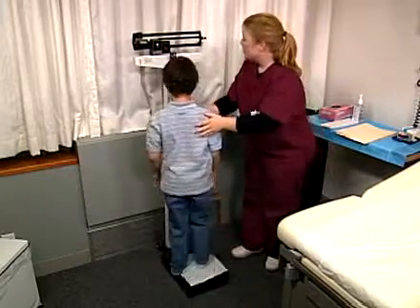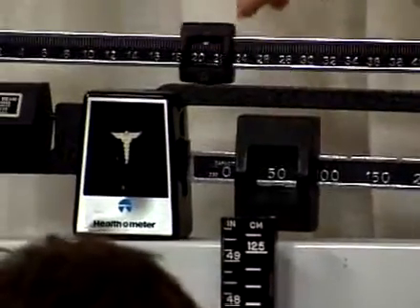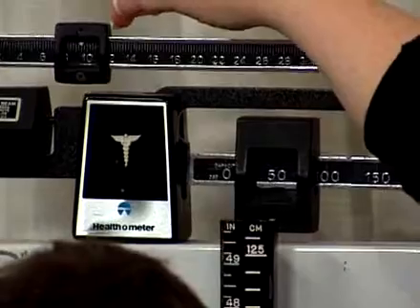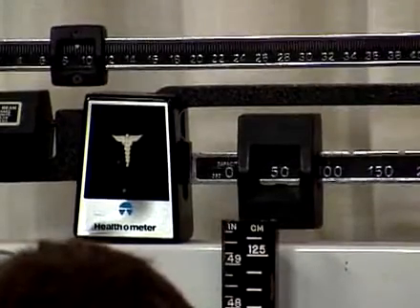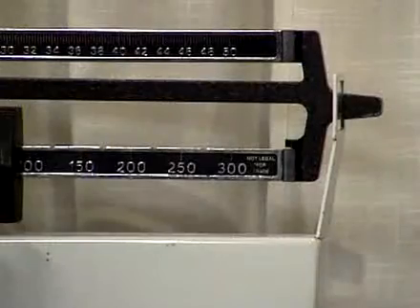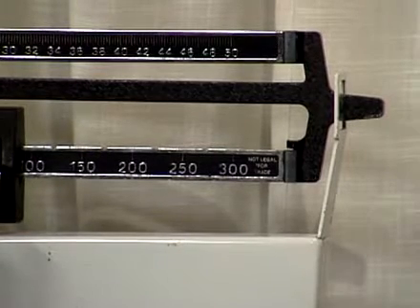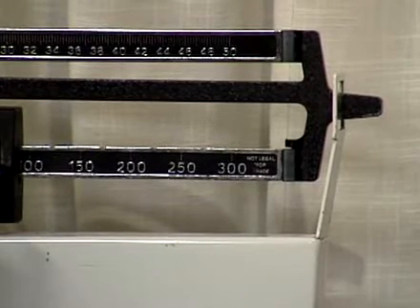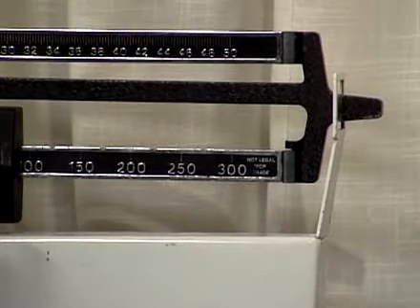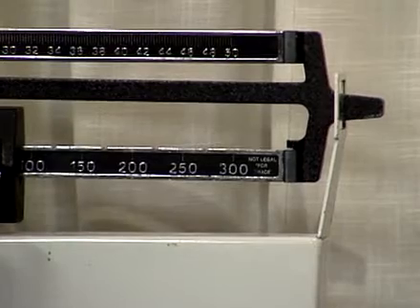With the patient on the scale, move the lower 50-pound weight to the right to the notch before the indicator point moves to the down position. Now move the upper 1-pound weight smoothly along the bar until the point floats equally between the up and down position. Make sure both weights are seated firmly in the appropriate notch. Add the two values together and read the weight to the nearest kilogram or pound.